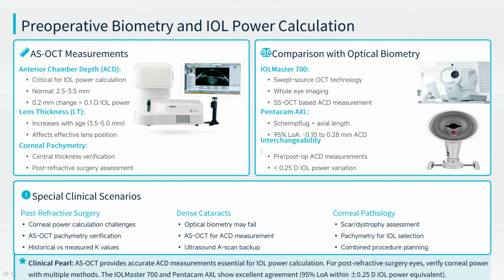Now, most of the 4th generation IOL optical biometry machines use swept source OCT for precise measurement of the axial length of the eye. And this precise measurement is very important, especially in phakic IOL implantations, and also for more detailed information about the biometrics of the eye, like the AC depth, the lens thickness, and the effective lens position.